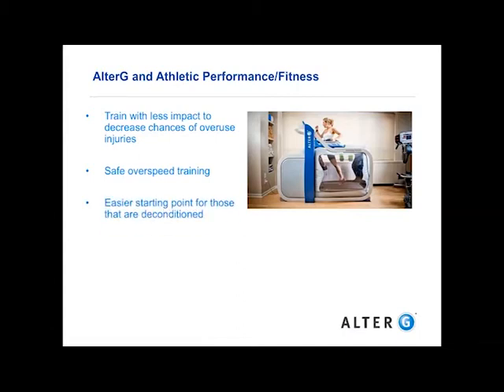For those that are deconditioned, that are trying to get back into fitness, it's a way to have an easier starting point. So if you can't tolerate walking as long on a regular treadmill or an elliptical, you can start easier on the AlterG, because we all know for those that are trying to get back to cardiovascular fitness or lose weight, you've got to train consistently for an extended period of time. You can't just be on a piece of equipment for 10 or 15 minutes.